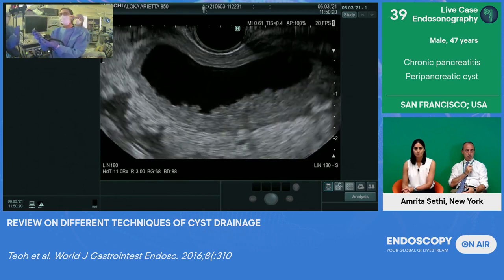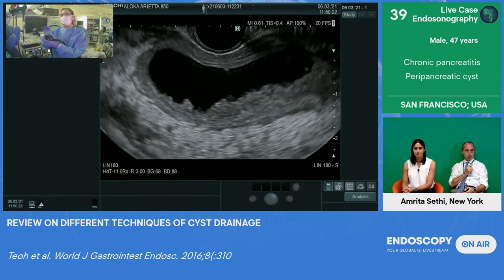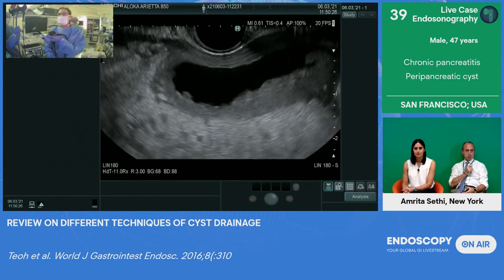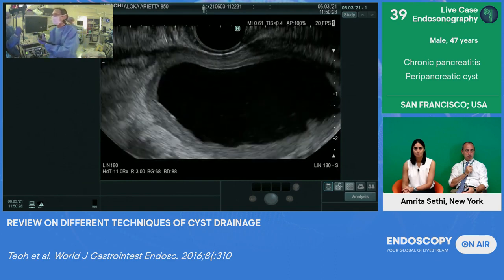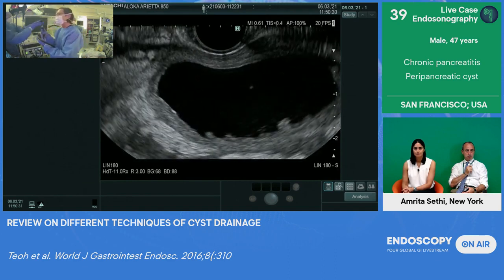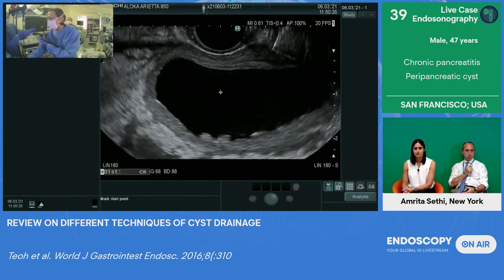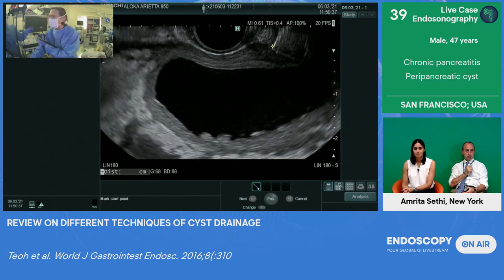And what's very important is that you not push this sheath against resistance, because then you can start to partially deploy. And when you're angulated, that's when you may get more resistance. So now you can see the sheath coming out. It's very echogenic. It's right up here.